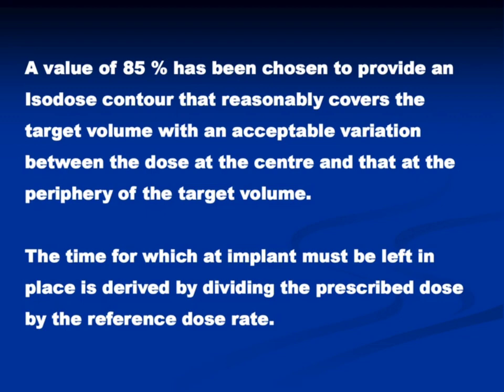Here you see the interstitial brachytherapy where the implant is being done, and there is the loop technique as well, in a diagrammatic view. Also you see here the single plane implant, and the loop technique. That is a form of interstitial brachytherapy.